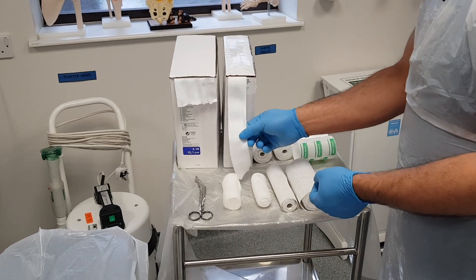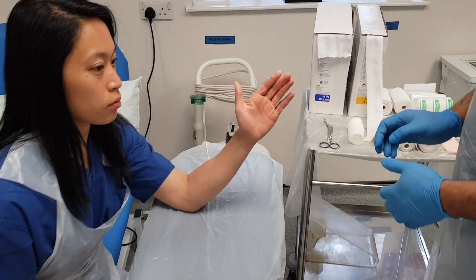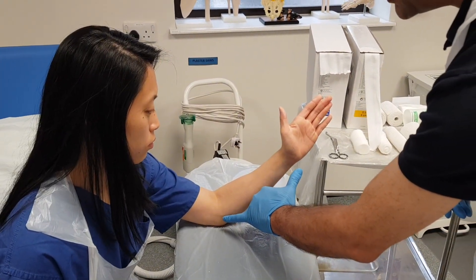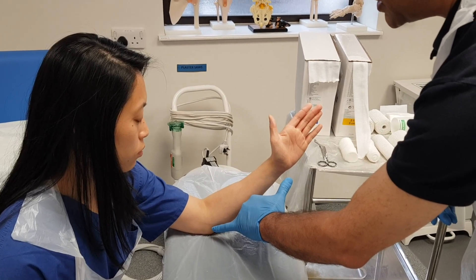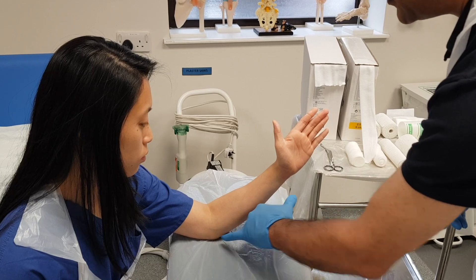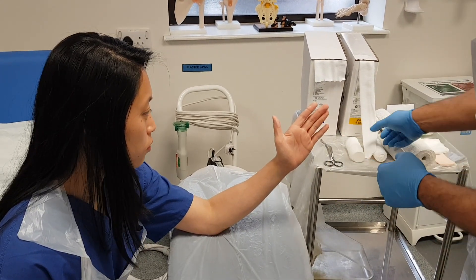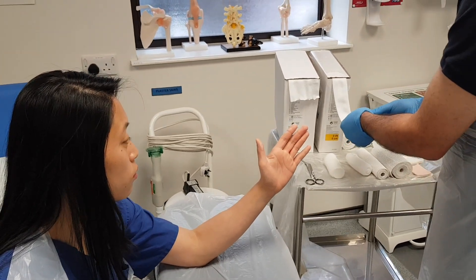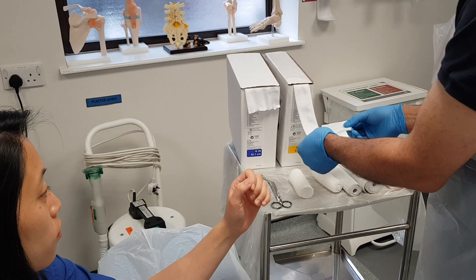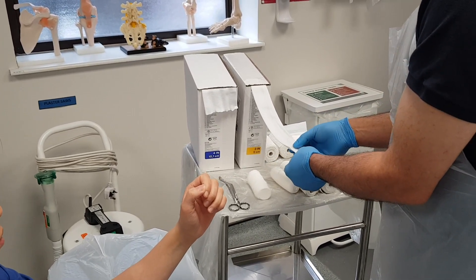First of all we're going to apply our stockingette. Jess is going to show me her arm and I'm going to measure. I want this to basically go from the crease in the antecubital fossa up to the metacarpal heads. Because when we apply this it can become shorter as it goes on, so we need to apply something that is longer than we think we need.